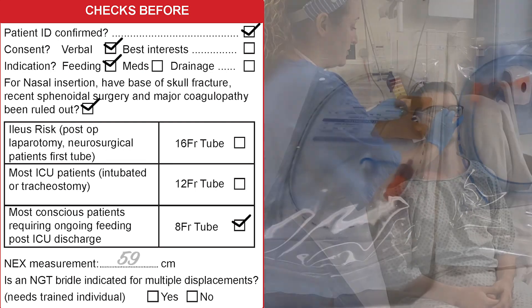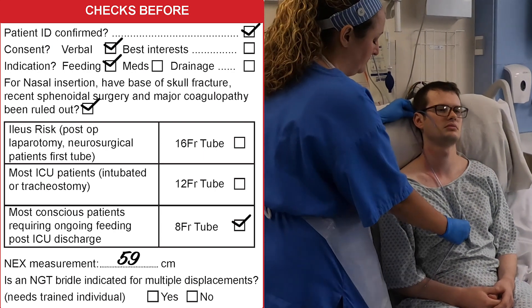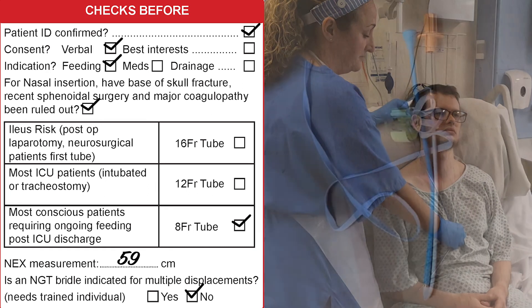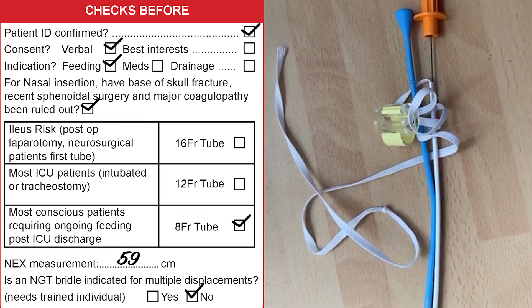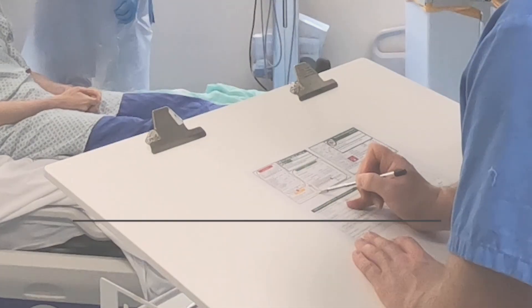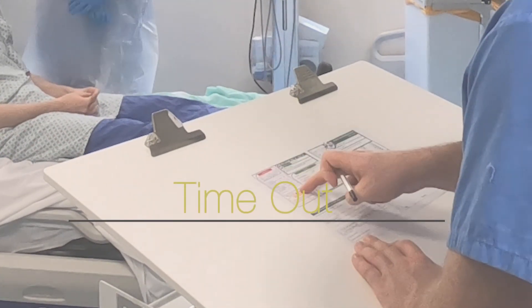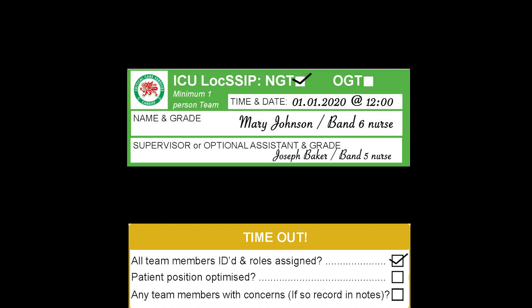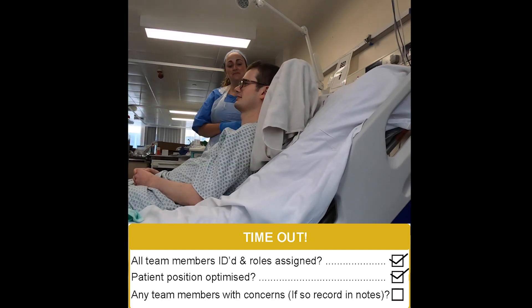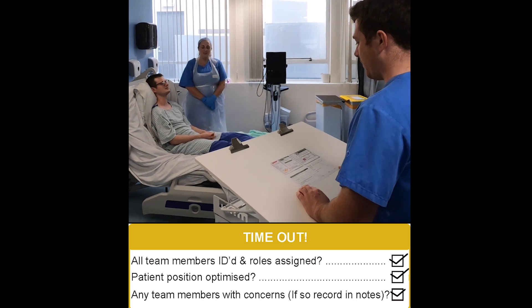The nose, ear, xiphoid process measurement should be taken, and if there have been multiple displacements it may be indicated to use a bridle. During the procedure a timeout should be performed and all team members' IDs and roles should be assigned. The patient's position should be optimised and concerns should be discussed at this point.